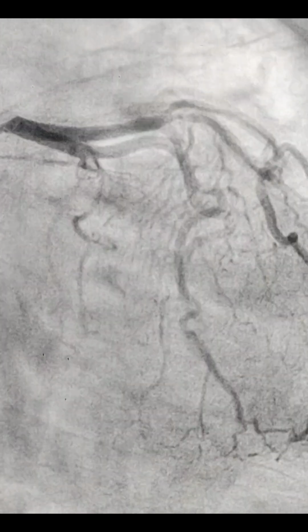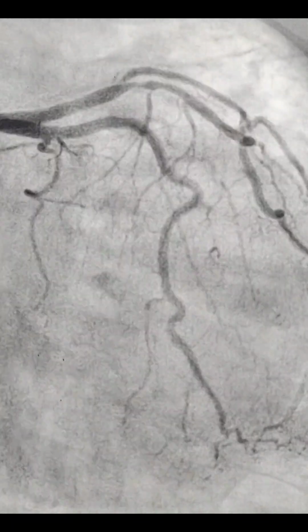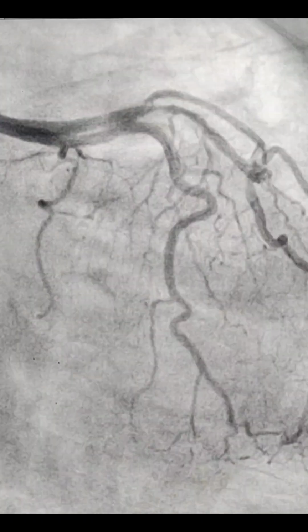There is ostial disease in the diagonal one, also significant disease, but the diagonal seems to be less than 1.5. So in the LAD, right after the diagonal, before the diagonal, there is significant stenosis. We decided to do the angioplasty for this patient.